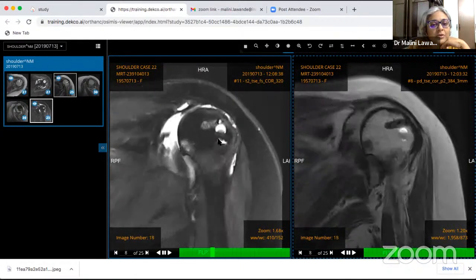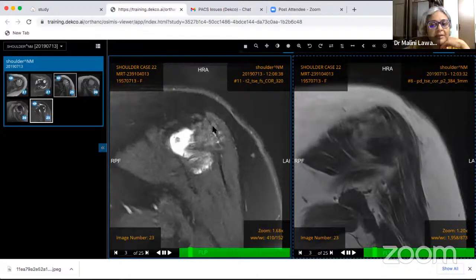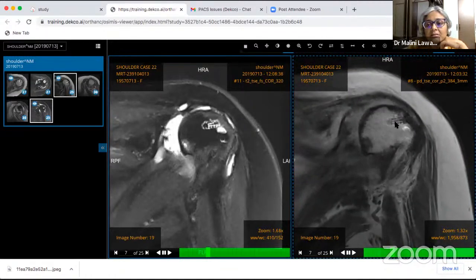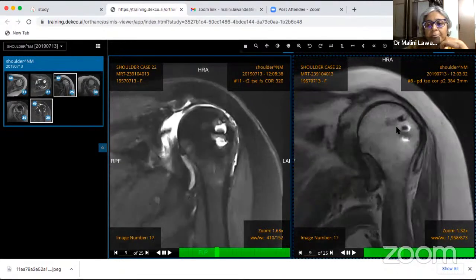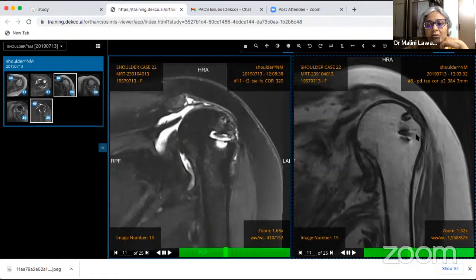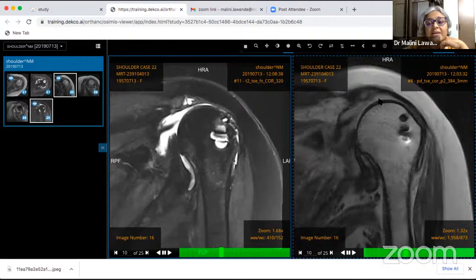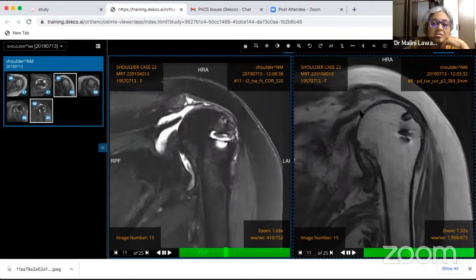So in this patient, you can see that the infraspinatus tendon shows severe tendinosis. Posteriorly, then it is torn. So these are the anchors. You can see here, the anchors can be seen well. There are these four anchors out here, in this location, but you do not see any tendon tissue going continuous up to it. So can you see this tendon is torn? So this is somebody who's had a re-tear.